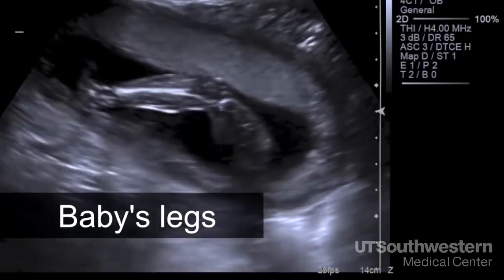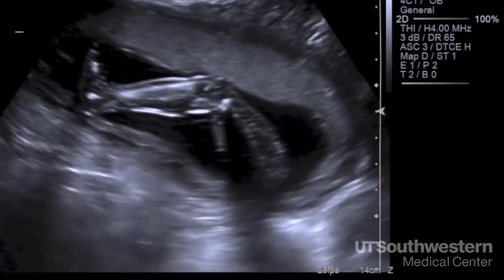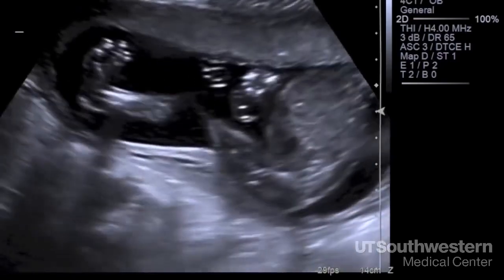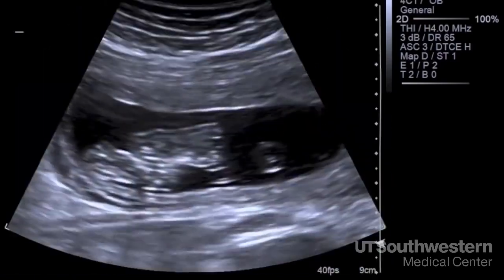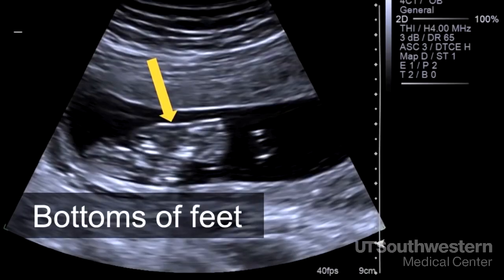I also want to look at the position of the feet coming off at the ankles and make sure they're nice and straight with no evidence of a clubbed foot. That's where the foot is turned in or out. And finally, these are the bottoms of both feet, like footprints.